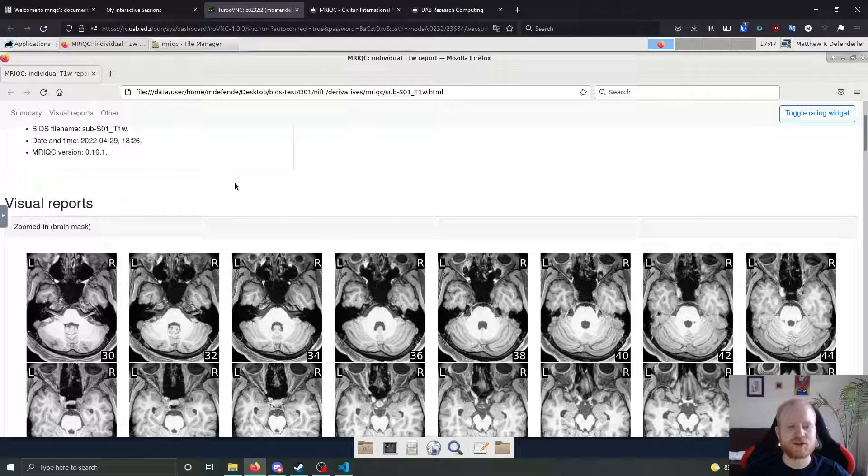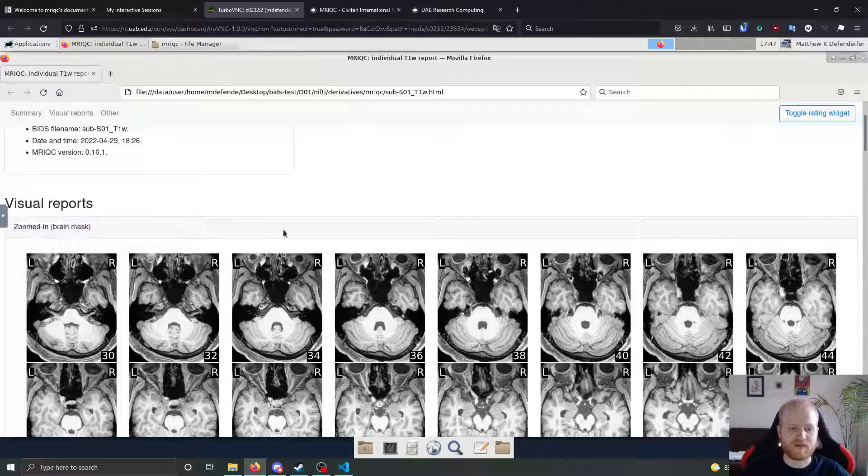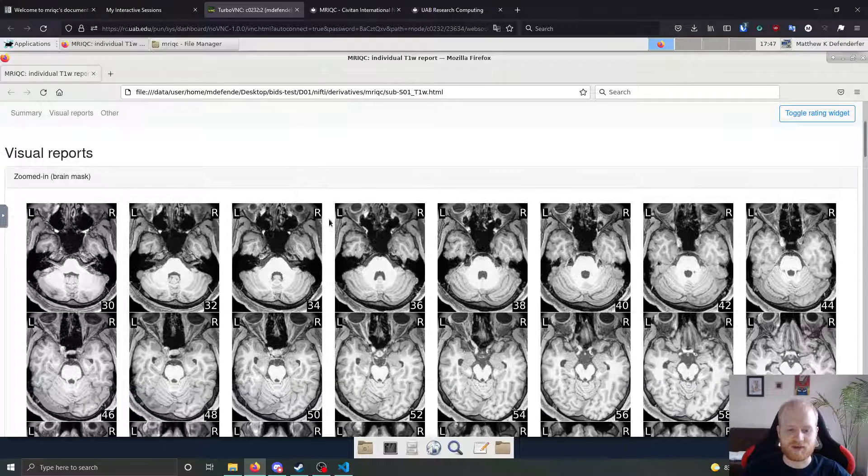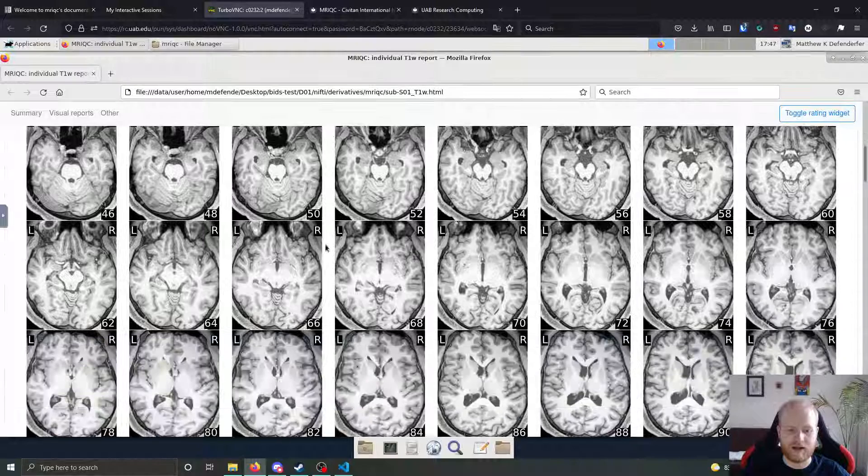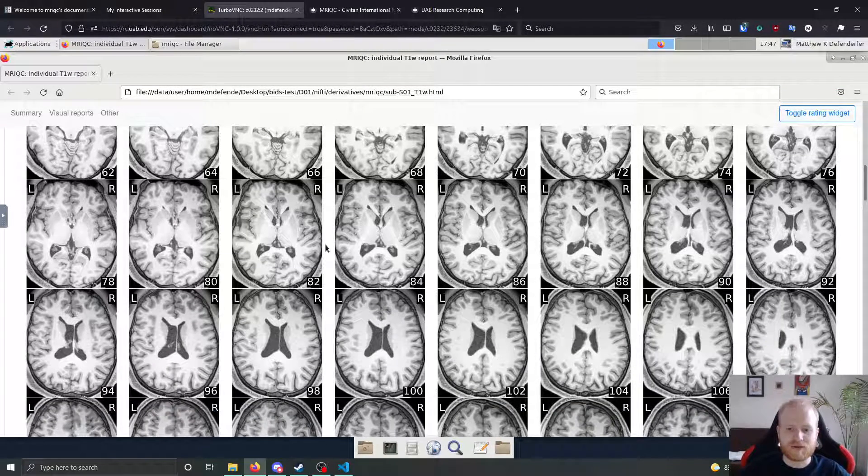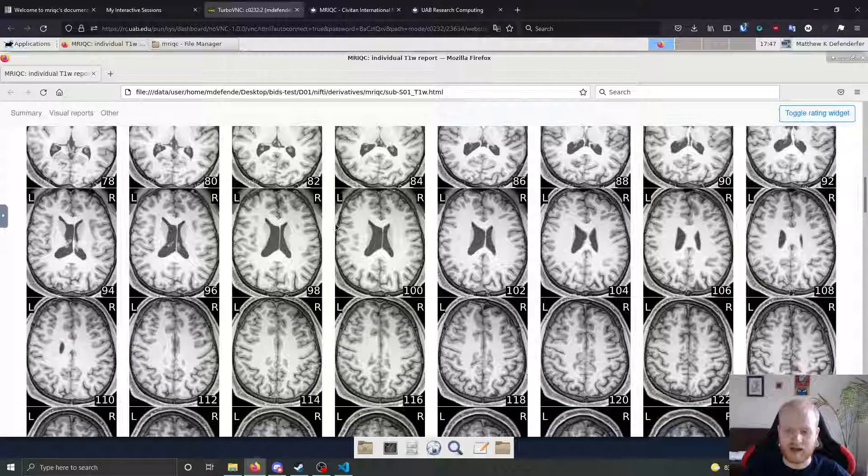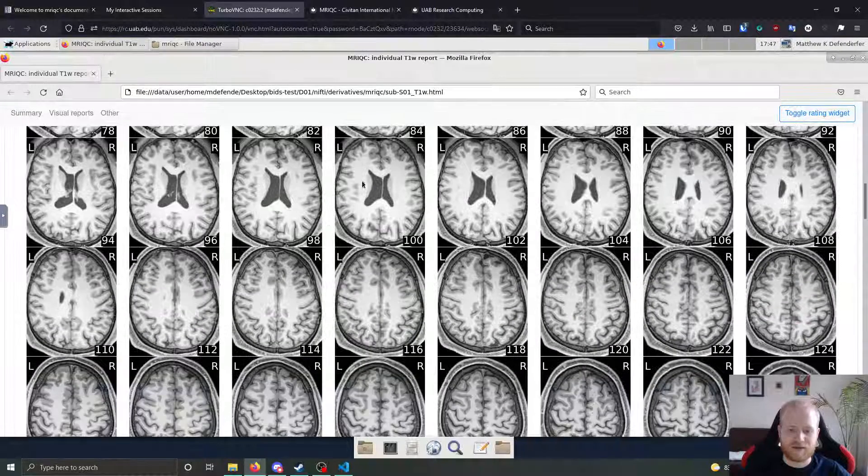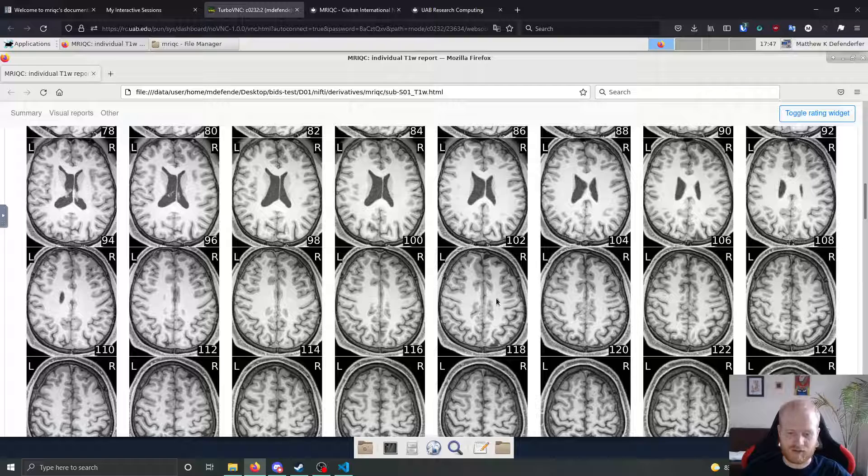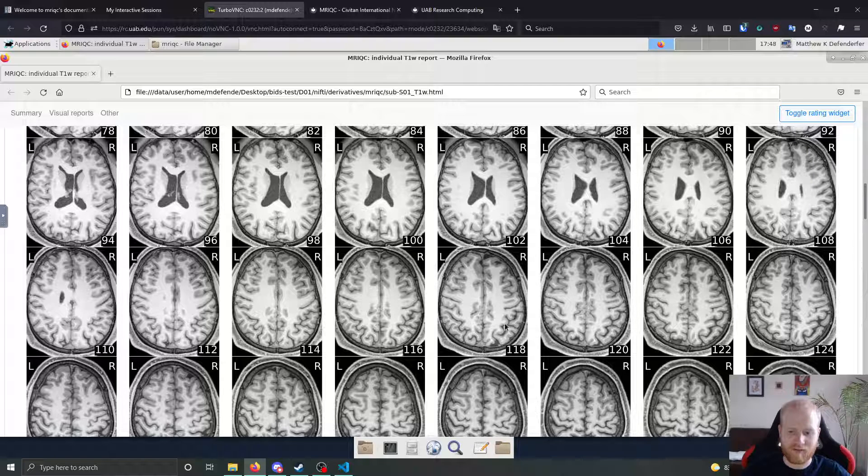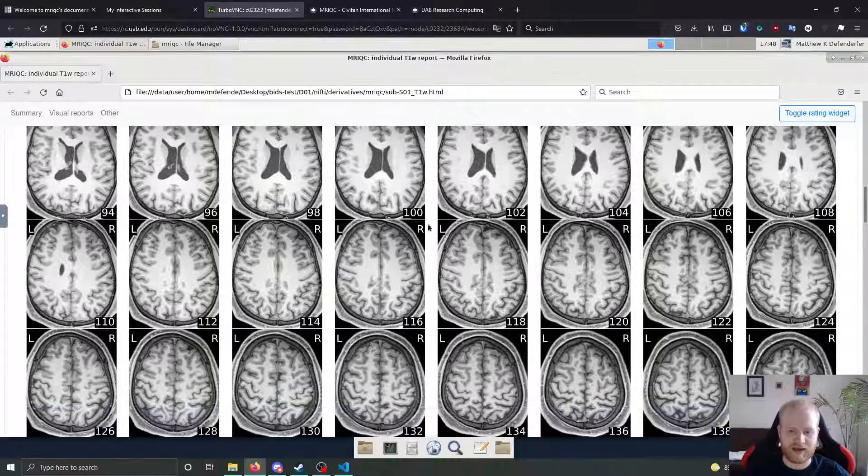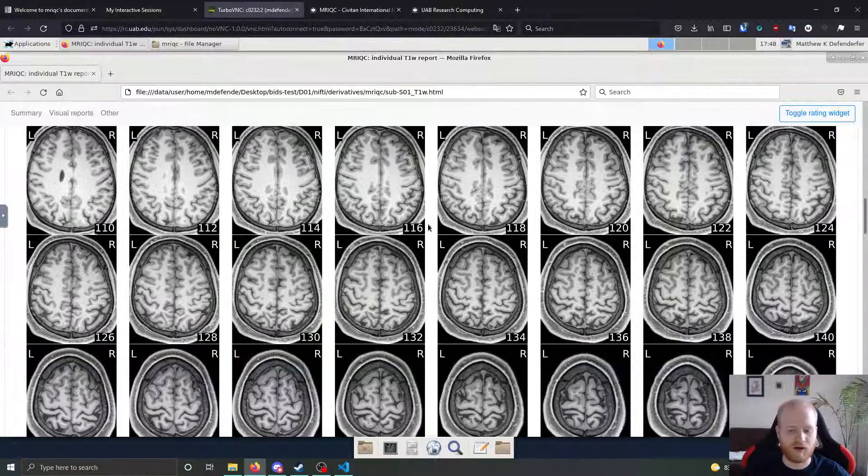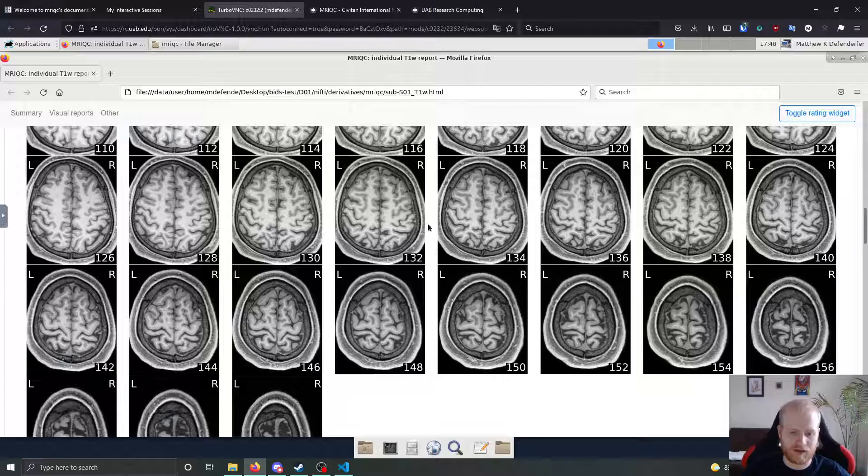For now, we're just going to go ahead and move this image rating widget and just look through what we've got. So the majority of the reports are going to be visual reports. In our case, these are going to be zoomed in brain masks for the T1 weighted image in a horizontal view. It gives you a pretty large number of slices to look at. And as we're looking through, this scan looks very good. Overall, there's a very high contrast between the white matter and the gray matter. It doesn't look like there's any sort of ringing artifacts or anything like that. Overall, a very high quality T1 image.